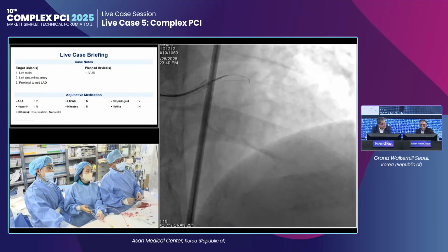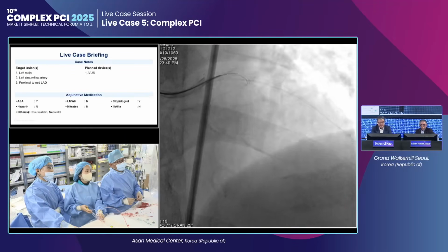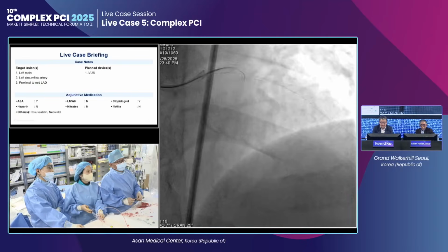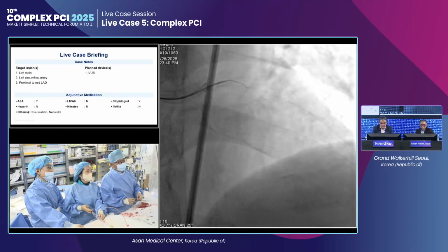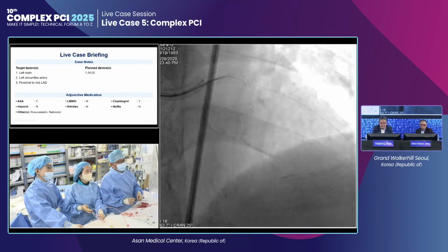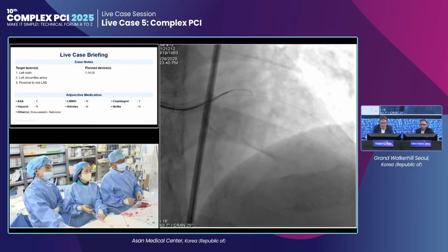It's amazing, the last session of the event, but then you picked very difficult cases, very complex ones. Frankly speaking, this patient came to my office the day before yesterday. Oh, okay. But that's even more amazing, that the guy is walking around with this.